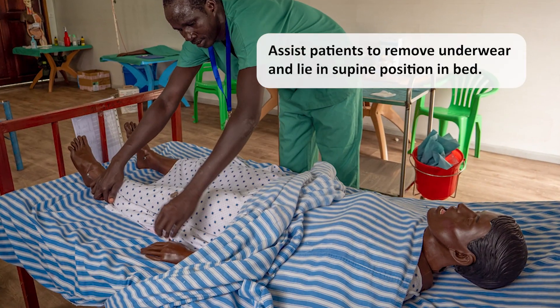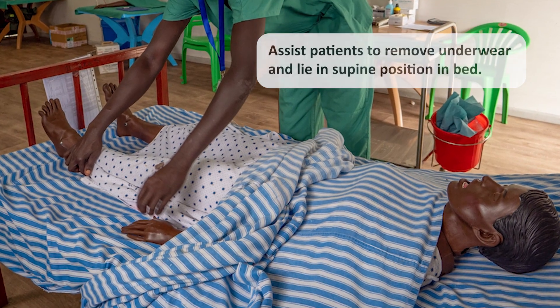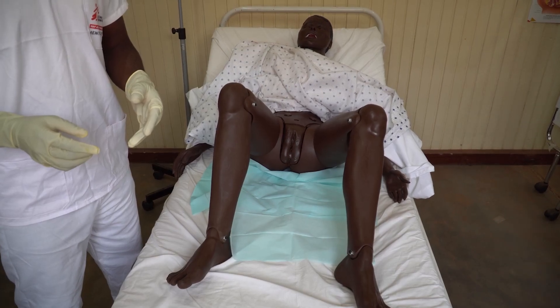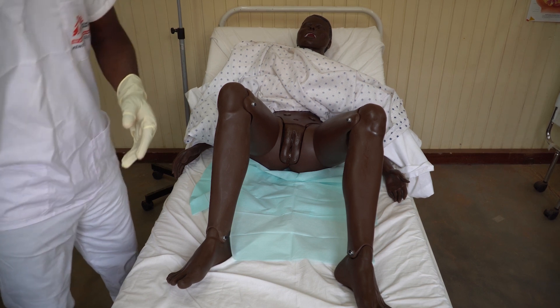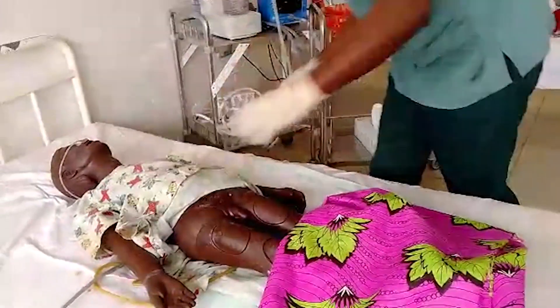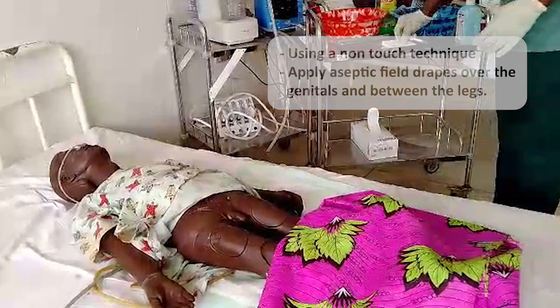Assist patient to remove their underwear and lie in a supine position in the bed. Position a towel or a draw sheet under the patient's buttocks. For female patients, have the patient bend their knees, hips flexed, and feet resting about 60 centimeters apart. For male patients, the legs can be extended on the bed. Using a non-touch technique, apply aseptic field drapes over the genitals and between the legs.